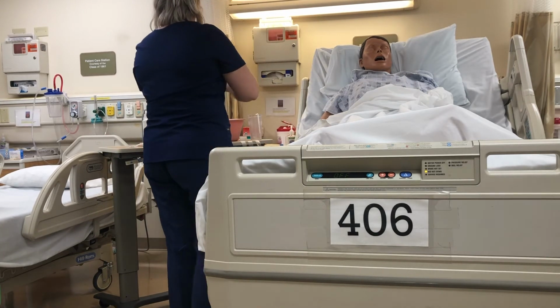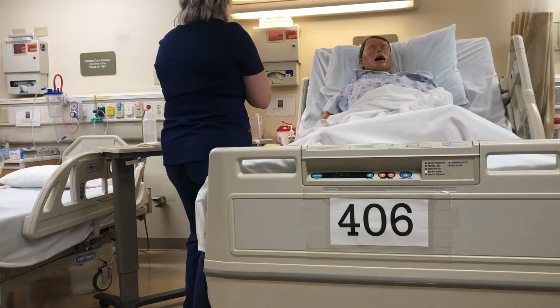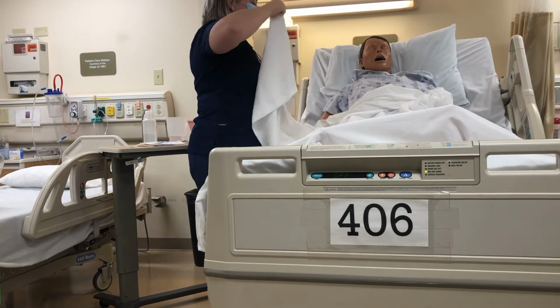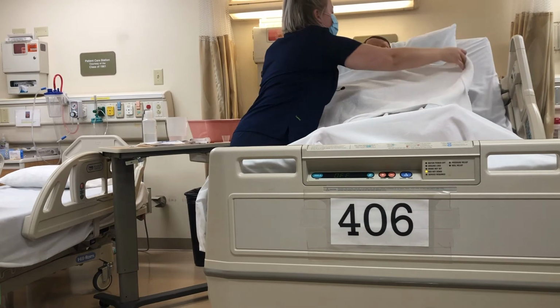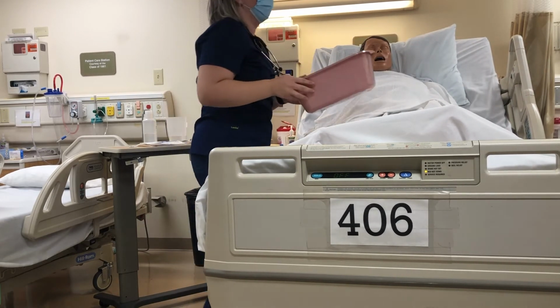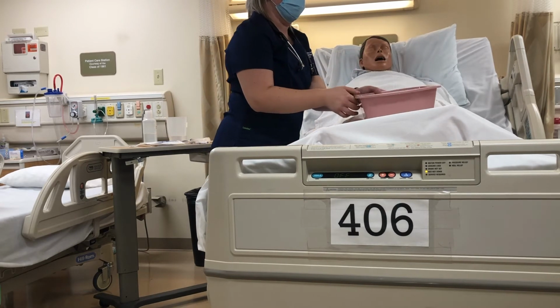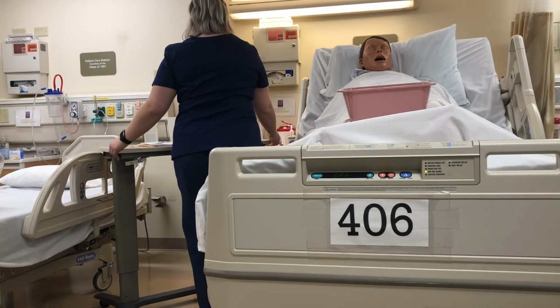I'm just going to check a few more things. I want to look at your nose, look at your mouth. I'm going to place this towel over you just to keep your gown nice and clean. And then if at any moment you start to feel nauseous or like you need this emesis basin, it's here for you. So I'll just place that in reaching distance for you.